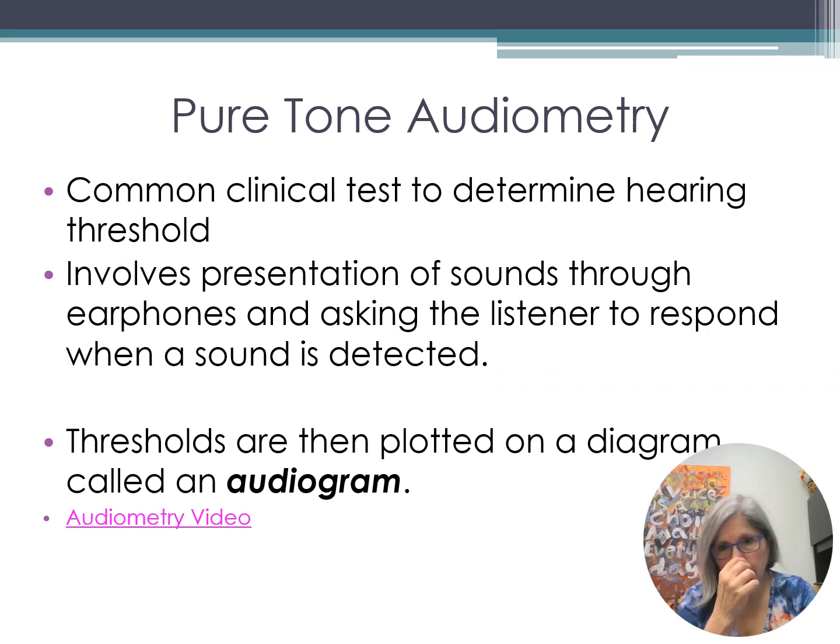For the adult section, I did not worry about talking about audiometry. So I'm going to do a quick review now just to make sure this is all very familiar to you again. Pure tone audiometry is what we start with. This is our primary measure. We have a number of other tests, but I'm going to focus on these today as we're talking about hearing loss in a very general sense. Consider that you have had information about audiology in more depth in other courses. So this is just that refresher.